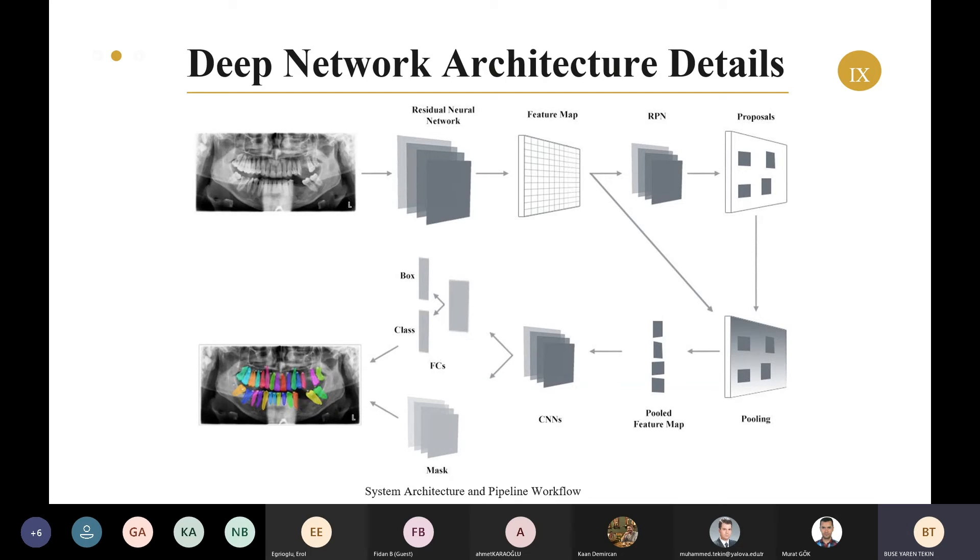The overlapping boxes are scanned according to the NMS algorithm, called non-maximum suppression algorithm. Our regions containing objects are divided into anchors with a certain threshold value, and we are choosing the 0.7 threshold value. With the anchor-based approach algorithms containing the model, the maximum values in the pooling layer are selected to the CNN and you can see in the output images.